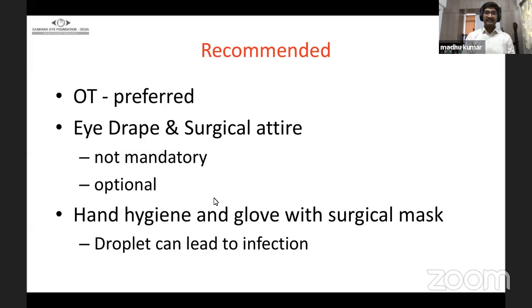And regarding the eye drape and surgical attire, the gown that we wear is not mandatory. Every institution has its own rule, but by and large, these are the guidelines. So you need not put the eye drape for the patient, but it is mandatory that the eye is cleaned properly with the 10% povidone iodine and a clean speculum is placed. And the injection can be given.